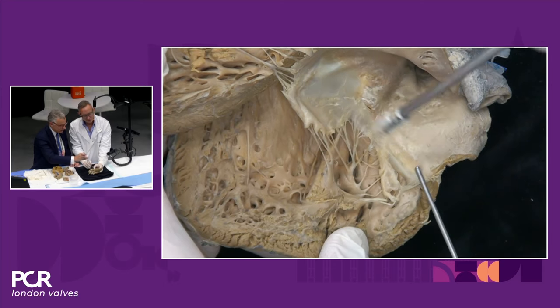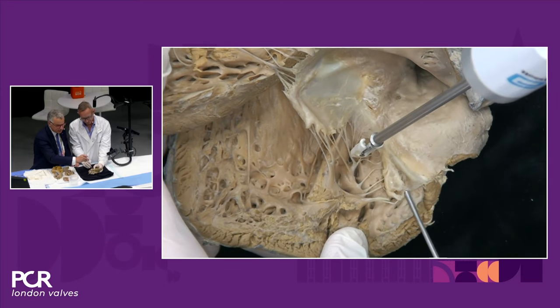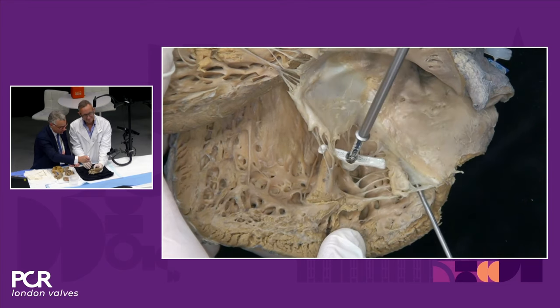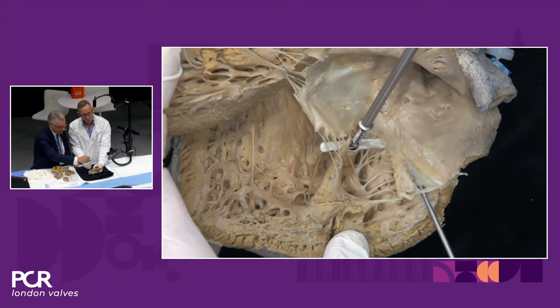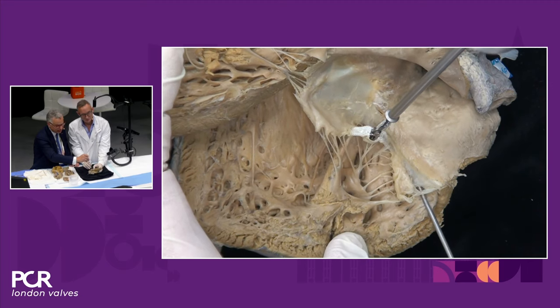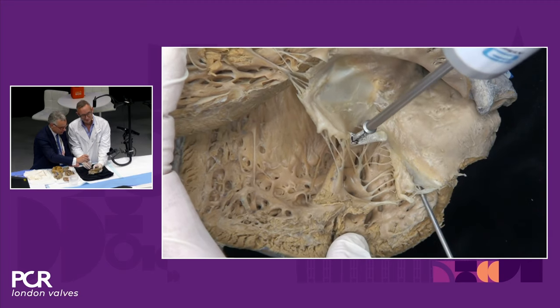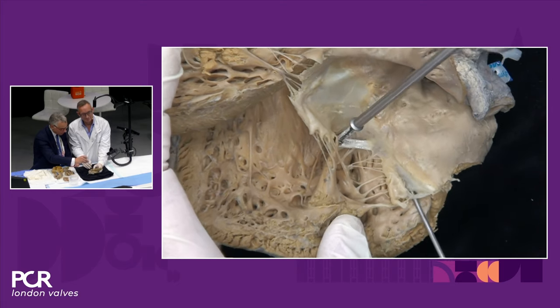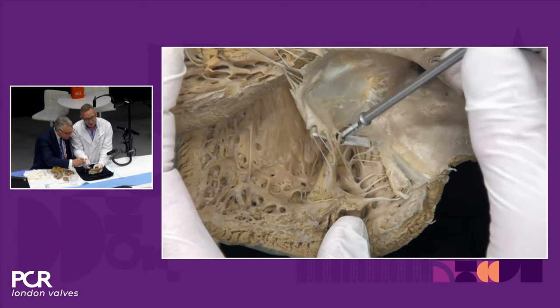But if you cross here with any asymmetry and you have the clip open, crossing with one clip arm in one region and the other one in this region, you can clock as much as you want. But as you pull up, it will be asymmetric. There is no way you can control the asymmetry. Now see. And now you're stuck.